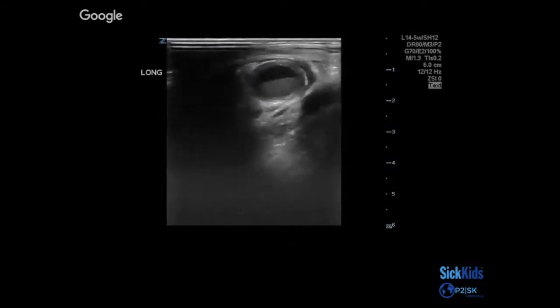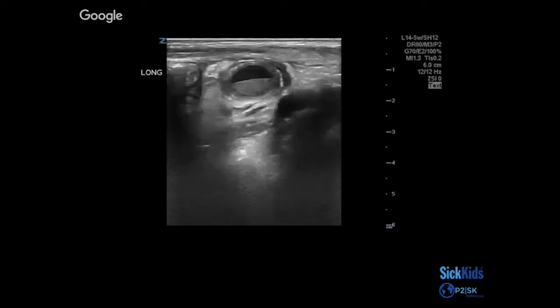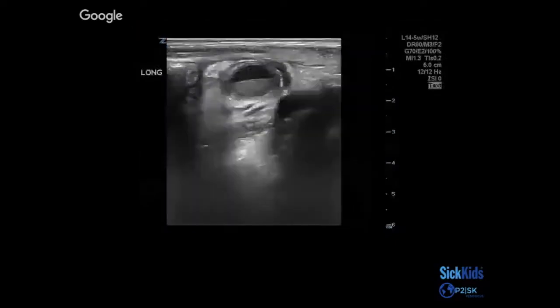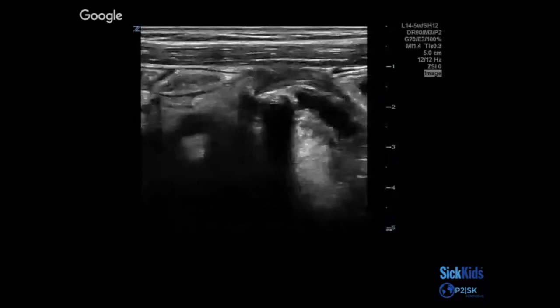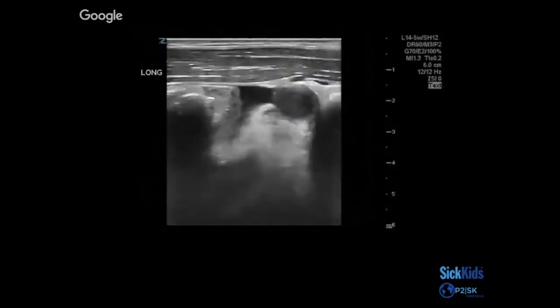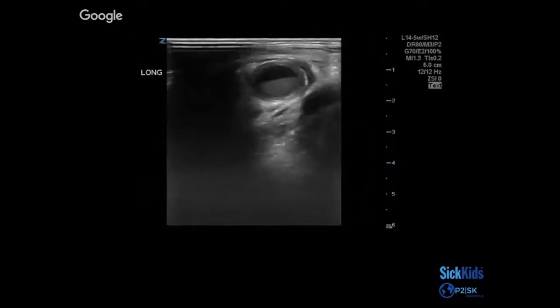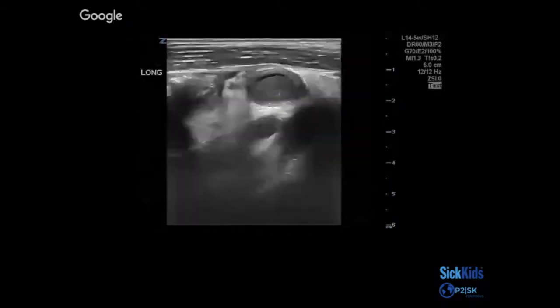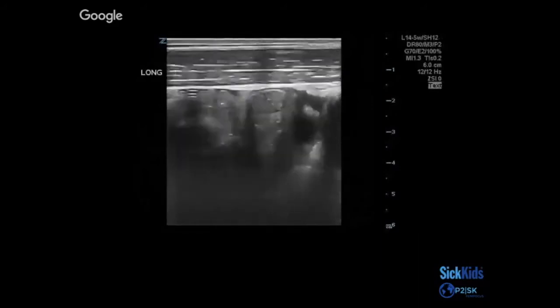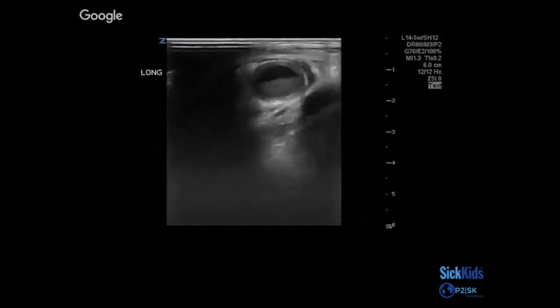This case shows appendicitis with debris and free fluid wedges around it. To the left of the screen there may be a VP shunt or PP shunt — an incidental finding. You can see reverberations — horizontal bright lines — on the left side. This kid had appendicitis with debris.